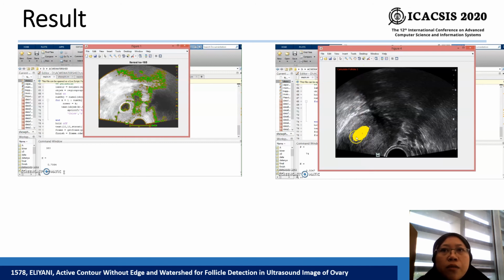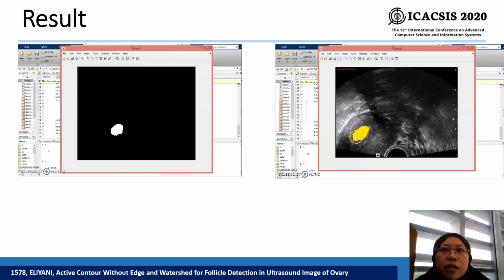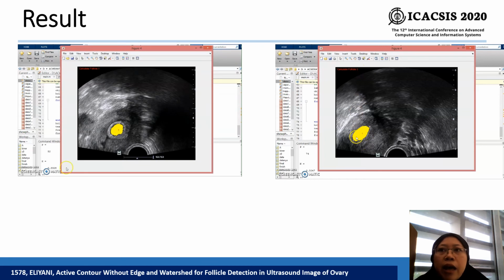The watershed transformation algorithm will be applied to the attached follicle objects so that it will speed up the computation process compared to applying the watershed transformation algorithm to all follicles. The distance transform operation is used on the attached follicle object and then the thresholding operation is carried out with the initial threshold value.